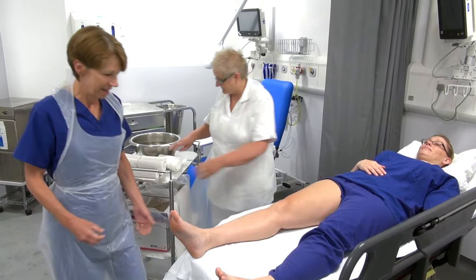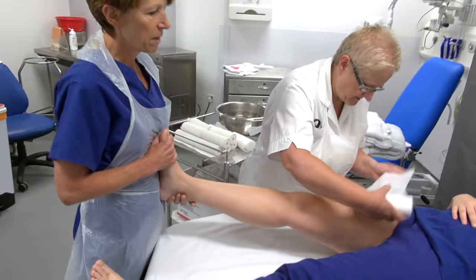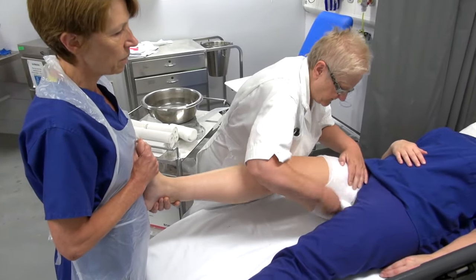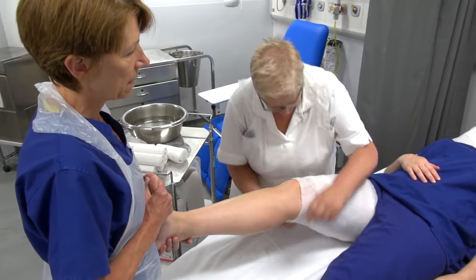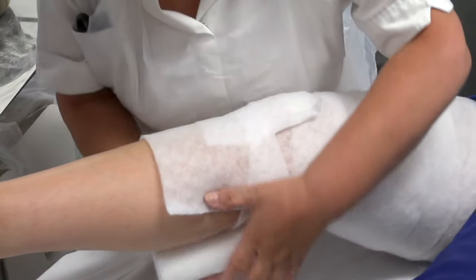So we'll get started. First I need to hold Anne's leg — this is going to be a full cast and we're going to put some padding on first, starting at the top of the leg and working our way down to the foot. Pam has left enough padding at the top to turn back, then applying the padding on 50-50 coverage for the rest of the leg.